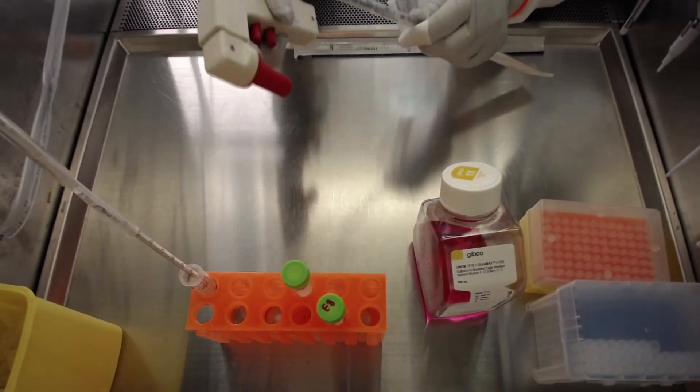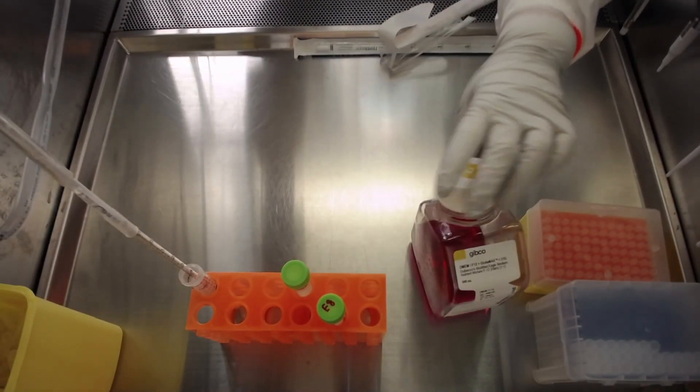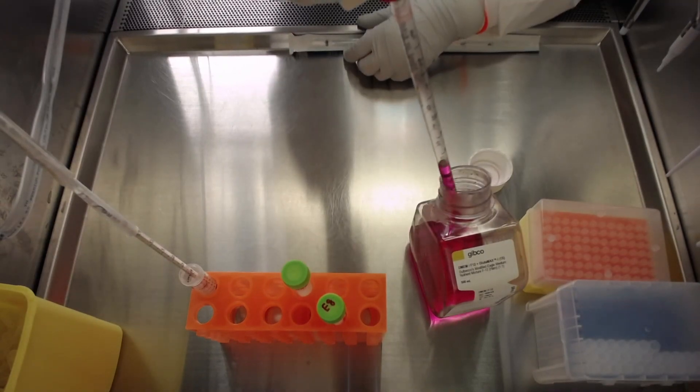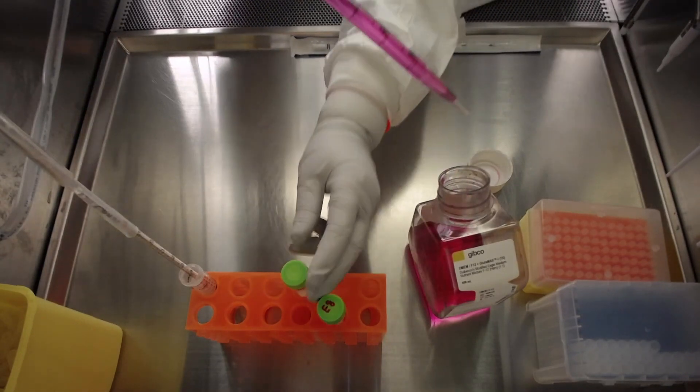Before thawing the cells, make sure all the necessary material is set up inside the biosafety cabinet, and add 9 milliliters of warm DMEM F12 media with anti-anti to a 15 milliliter sterile conical tube.